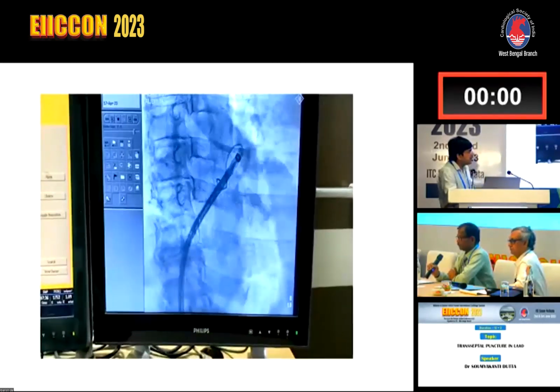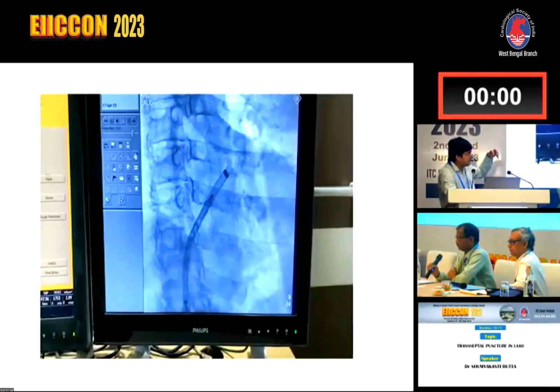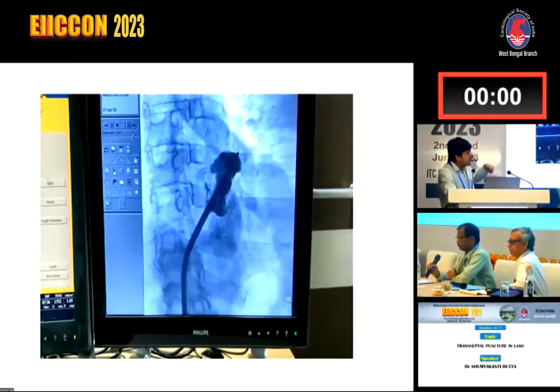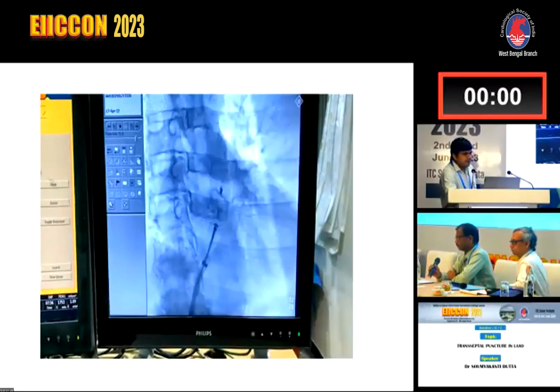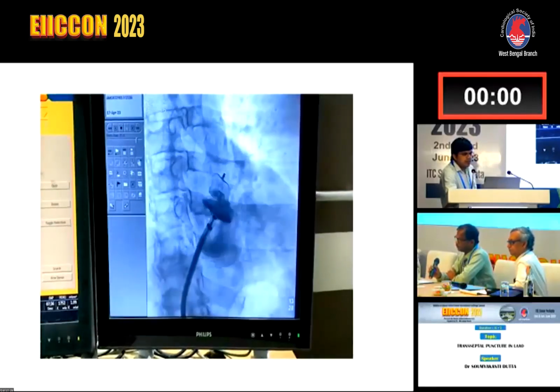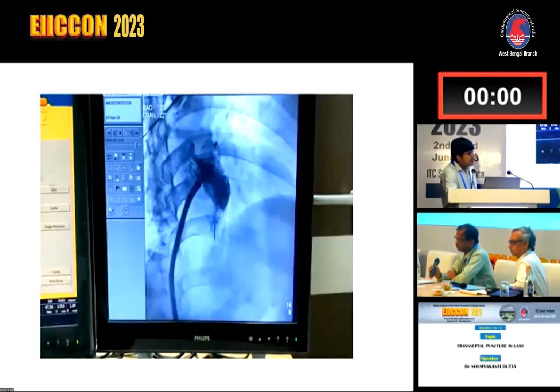Once it has an onion-like structure, the first lobe is released, then pull it back, and automatically the second flap is released. So it is easier if you are able to do all these things. So the anatomy evaluation is absolutely necessary, sir.